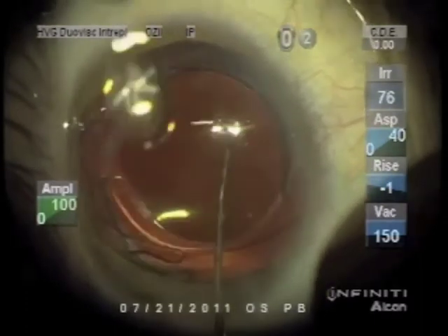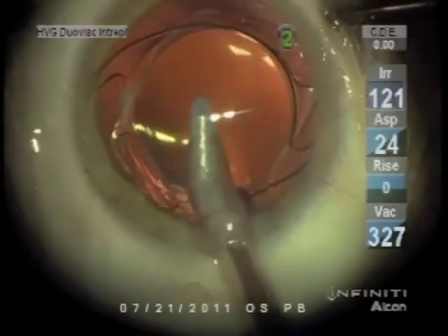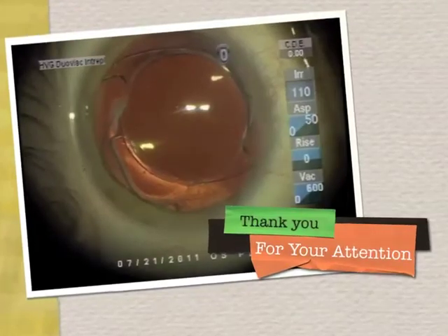The toric ones have to be positioned appropriately, but this is just a spherical power. It's important to remove viscoelastic from under the lens as well as from the anterior chamber.